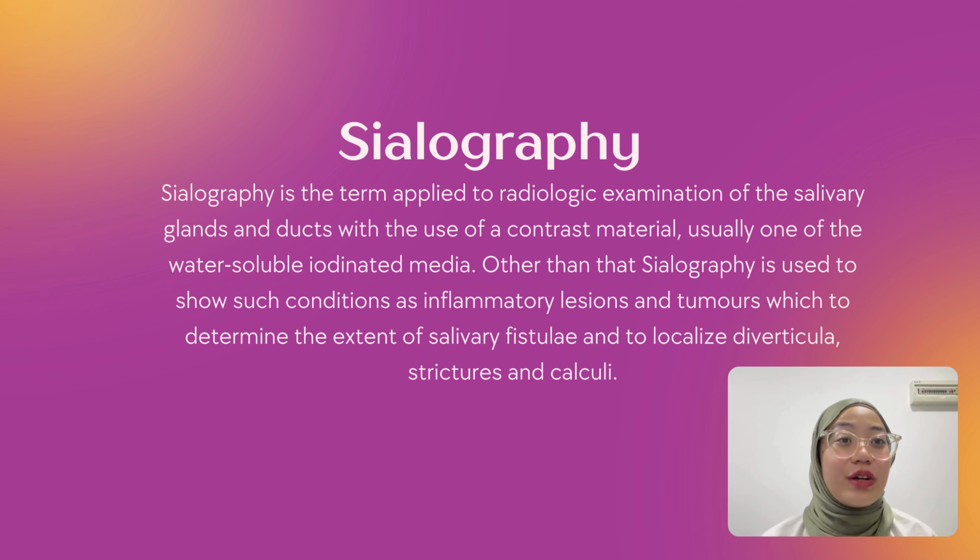Sialography is a radiologic examination of the salivary ducts and glands with the use of contrast media. It is also used to show conditions such as inflammatory lesions and tumors, to determine the extent of a salivary fistula, and to localize diverticula, strictures and calculi.